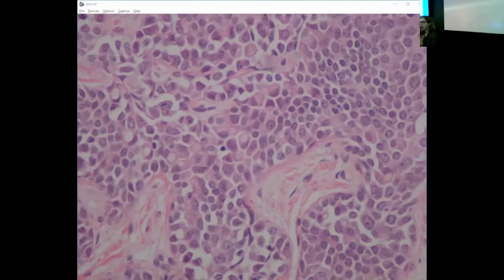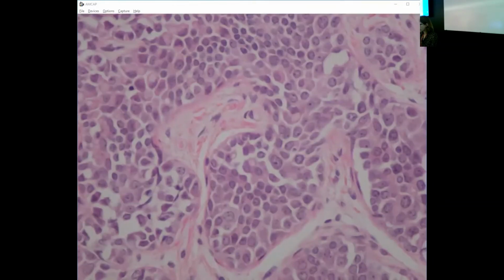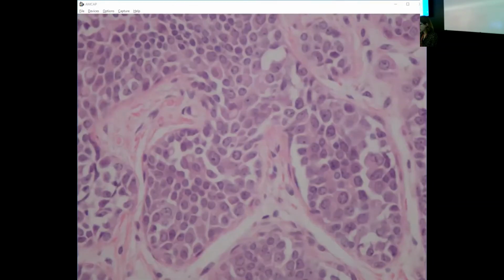So we have no obvious architectural atypia in the form of polarization, cribriforming, bridges or arcades. We have a discohesive population. We have intracytoplasmic vacuoles. As for nuclear atypia, I think there's some considerable variability in nuclear size and shape here. Maybe more of them are type B nuclei.